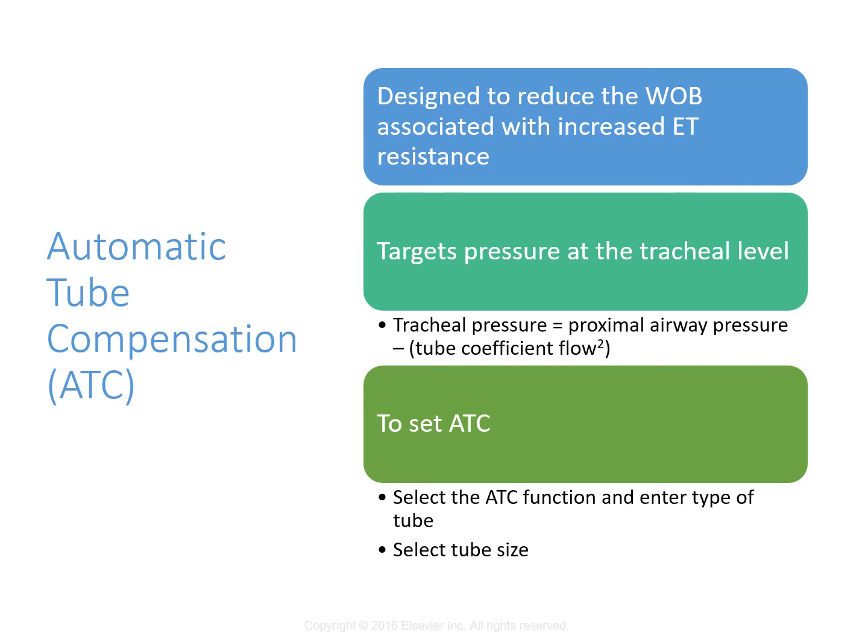So to overcome that problem, there are some ventilators, like Medtronic makes one of them. The Dräger makes another one. I think General Electric also had one. They make a feature called automatic tube compensation. And the whole design was to specifically, right, surgically, in a way, reduce the work of breathing with that increased endotracheal tube resistance.